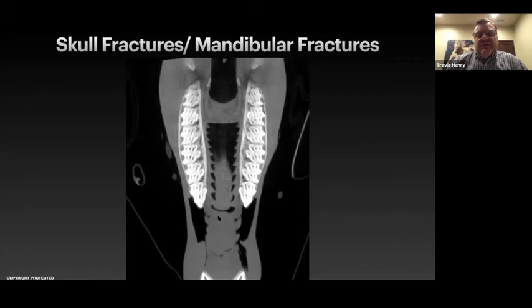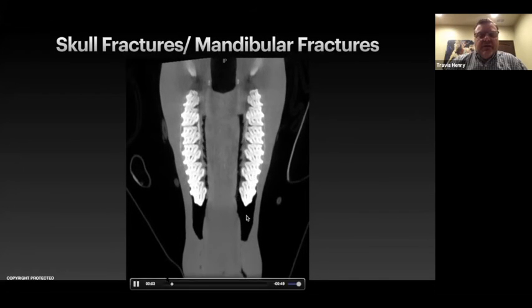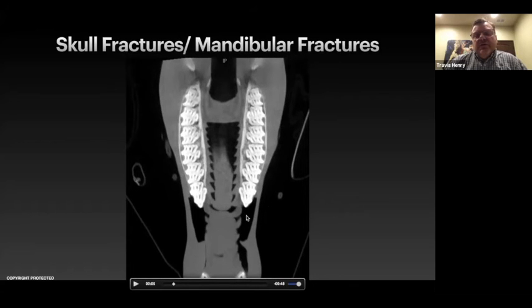So this was a case of a younger horse that came in, I believe, that had an enlargement over the side of its face that was presumed to be a tooth root infection that had sprung up over the course of a few weeks. And the horse was very painful, kind of on the leading edge of the facial crest. And when I did the oral exam on this horse, the tooth looked entirely normal.